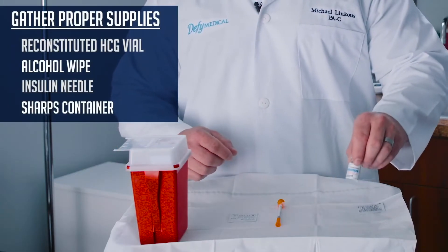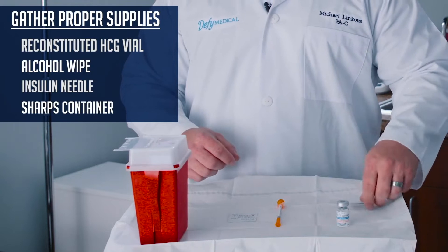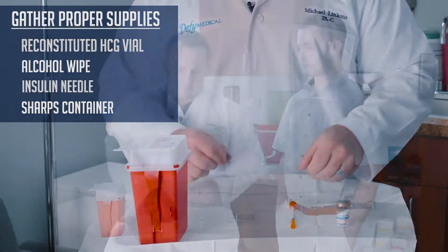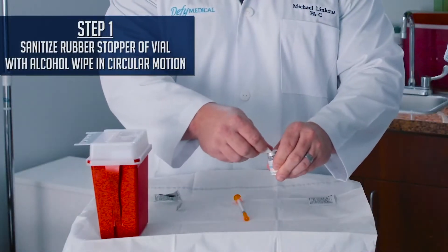First, grab your HCG that you've reconstituted out of the fridge. Then make sure that you have an alcohol wipe. Grab your insulin needle. Take the alcohol wipe and sanitize the top of the HCG bottle in a circular motion.